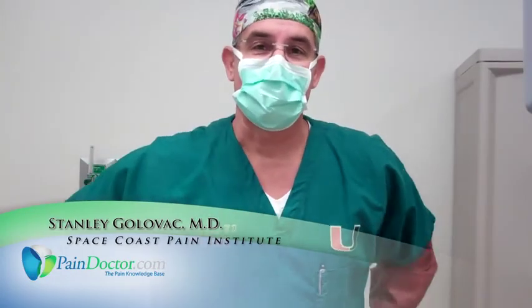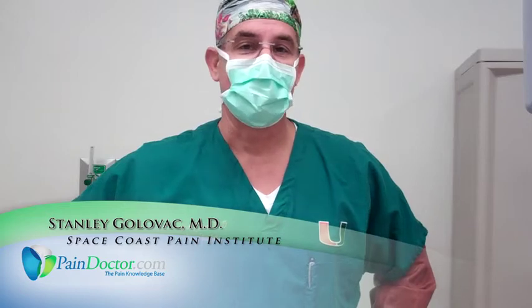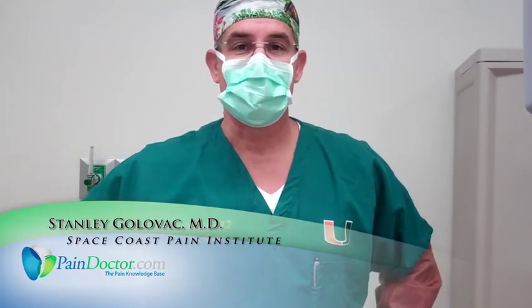Hi there, I'm Dr. Stanley Golovac here at SpaceCoast Surgery Center. Today we're going to be performing what's called a ganglion impar block on an individual who has a condition called coccydynia.